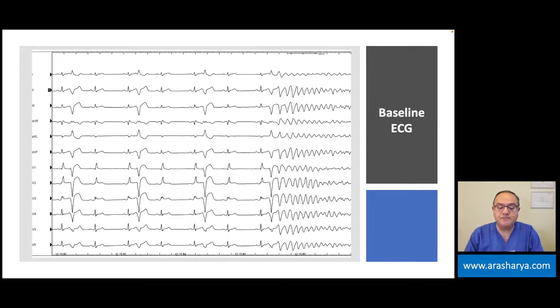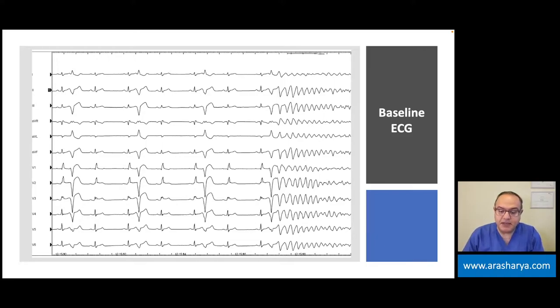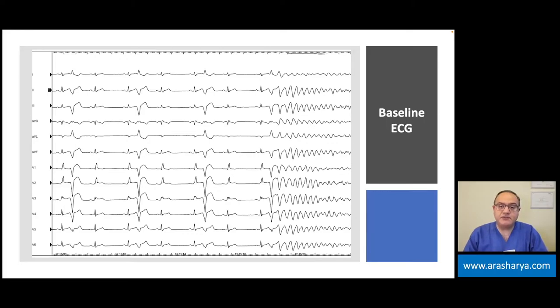The ECG shows sinus rhythm and frequent premature ventricular complexes (PVCs) with negative concordance, superior axis, and positive morphology most compatible with ECGs from the right ventricle in the region of the moderator band. As you can see in this patient, these PVCs created recurrent ventricular fibrillation.